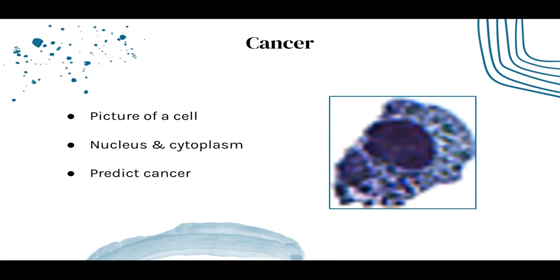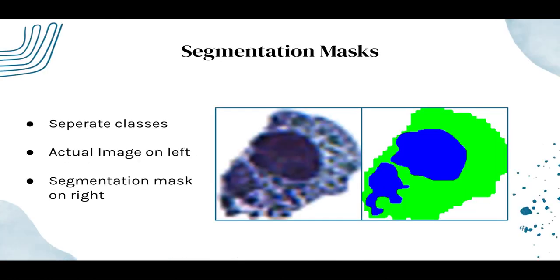In this specific kind of cell from the urinary tract, you can predict if it's malignant for bladder cancer by literally just seeing if the nucleus of the cell is big compared to the rest of the cell. If the nucleus is big, then that means that chromosome replication has taken place too frequently and that it's probably malignant for cancer. And so we can make a diagnosis using this information by making segmentation masks.